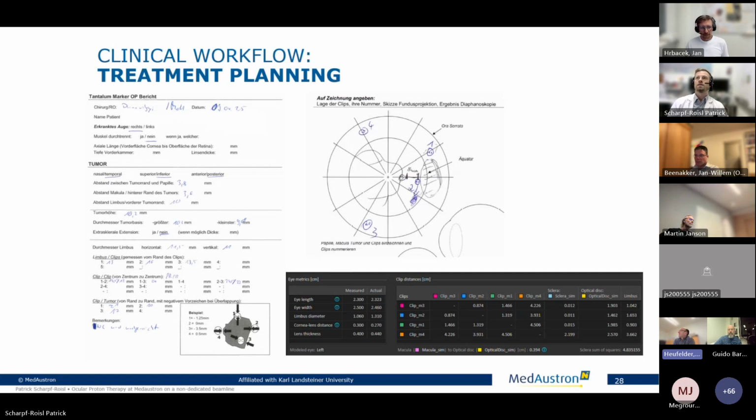Thank you. So the distance between range shifter and collimator is, we have 67.5 centimeters from the collimator to the nozzle exit, and then additional 8 centimeters to range shifter, so a total of roughly 75 centimeters. And the maximum aperture size we can mount is a diameter of 4 centimeters.